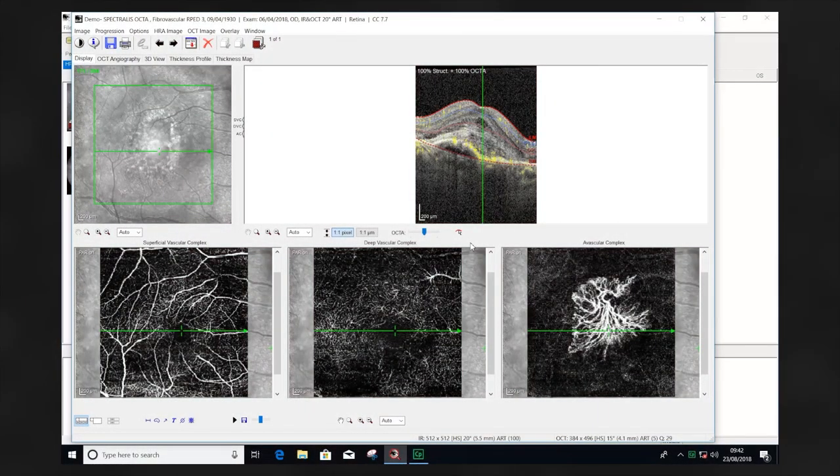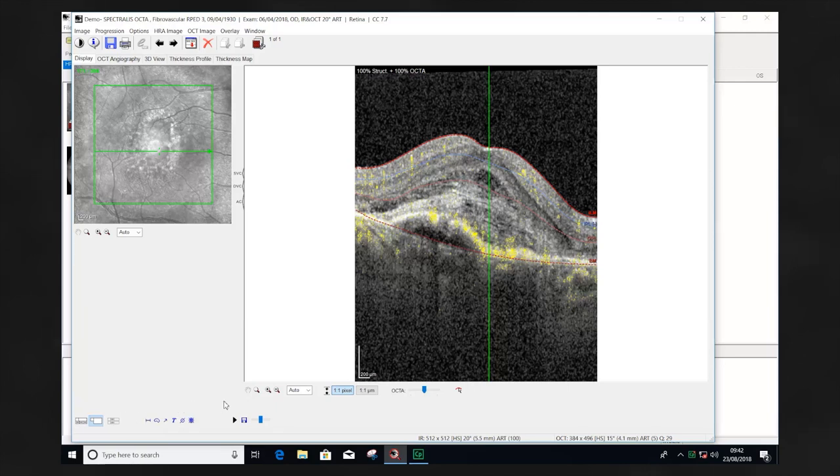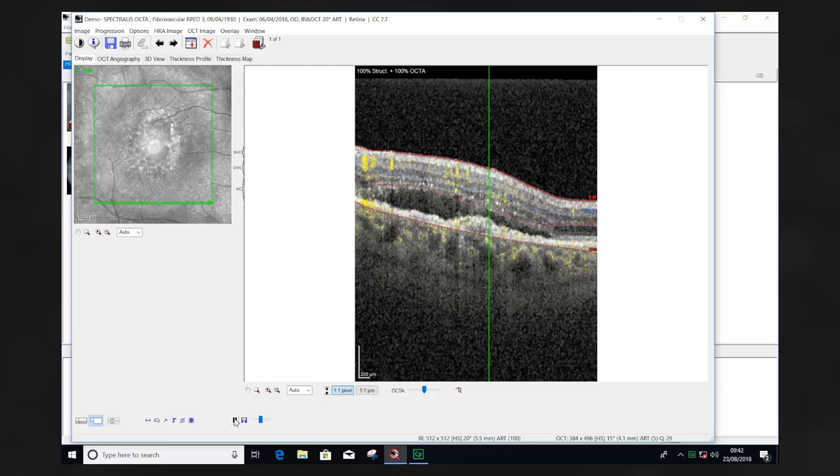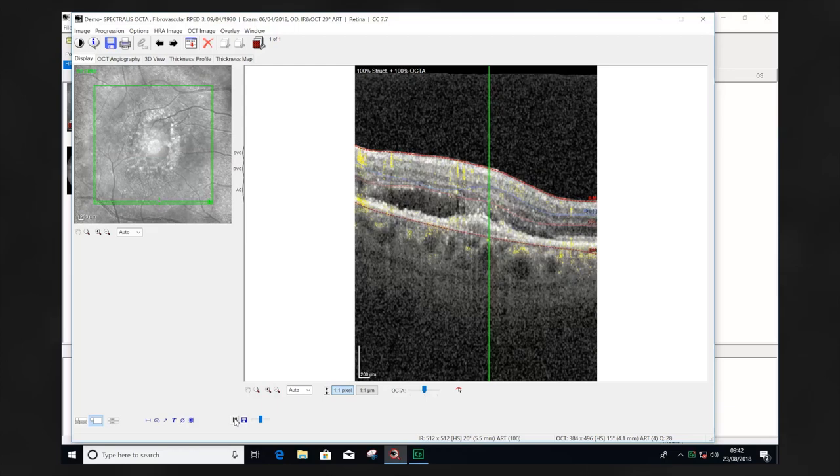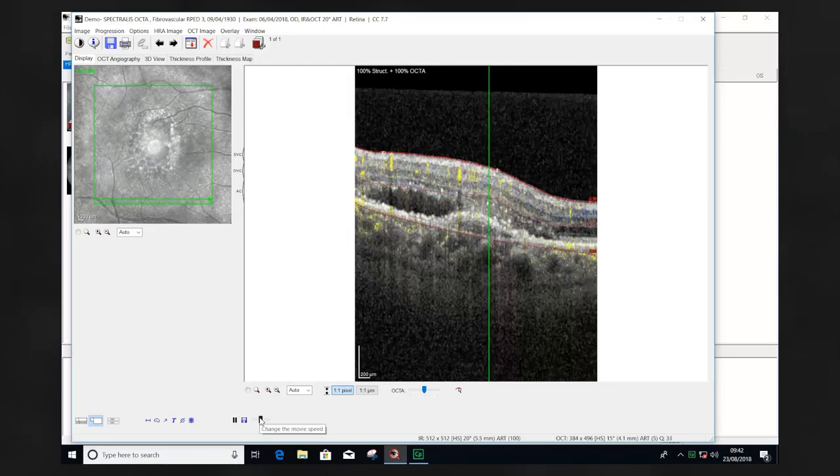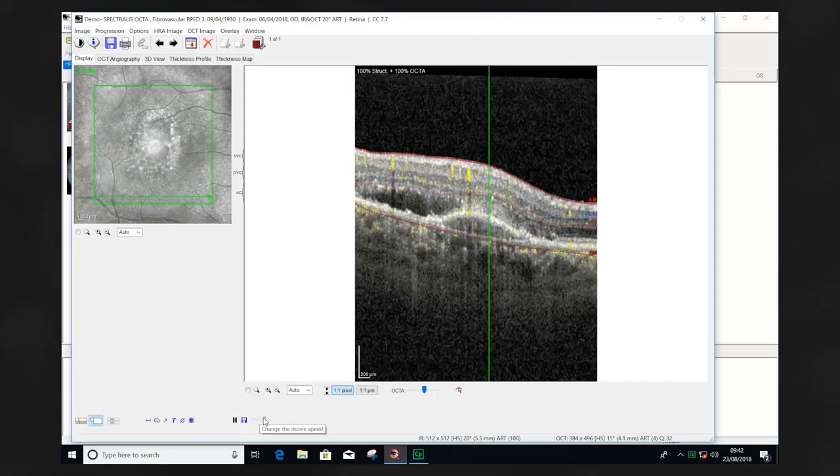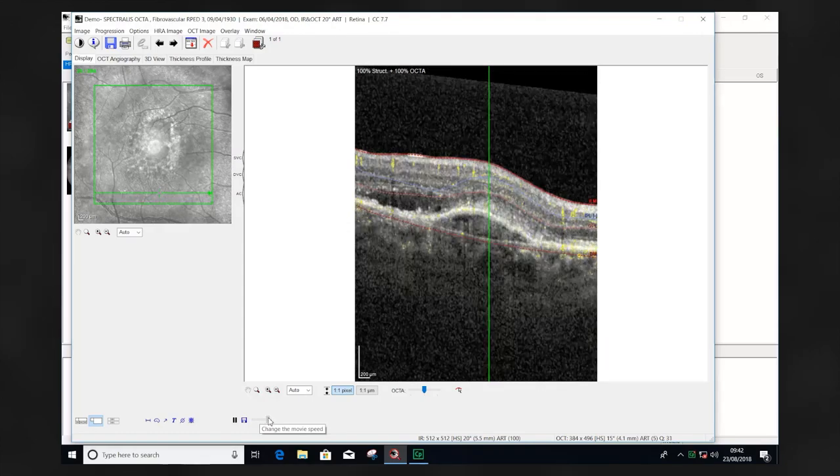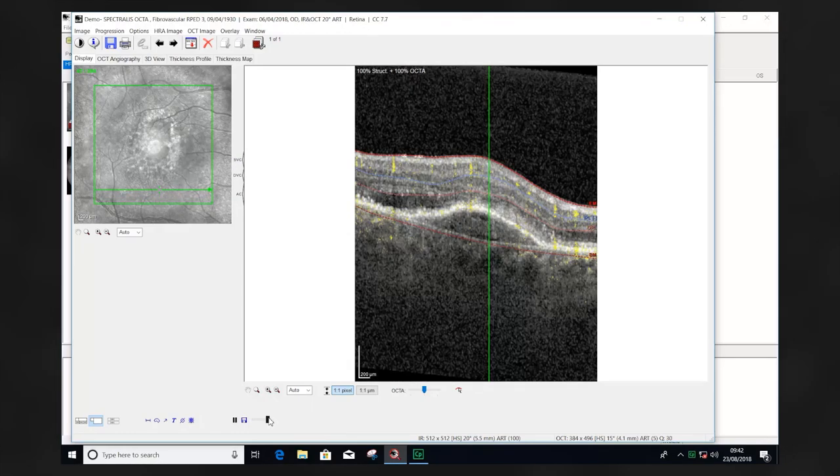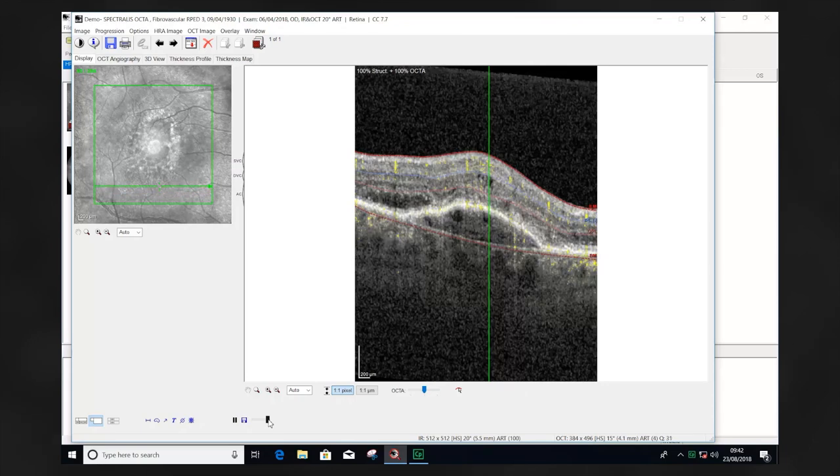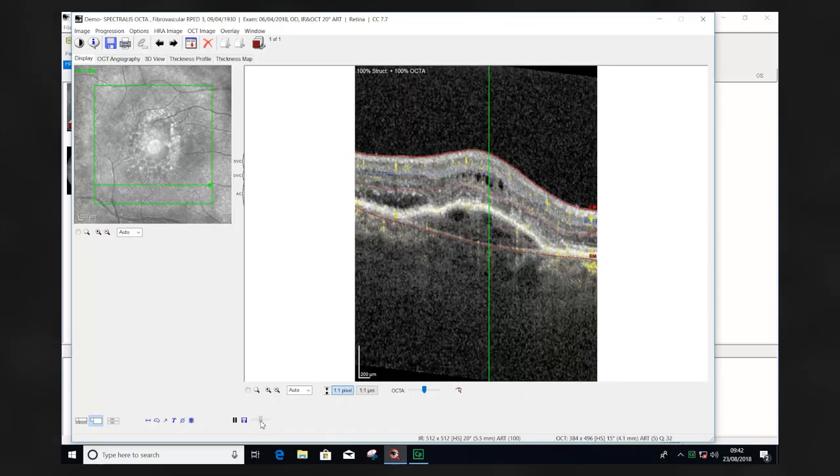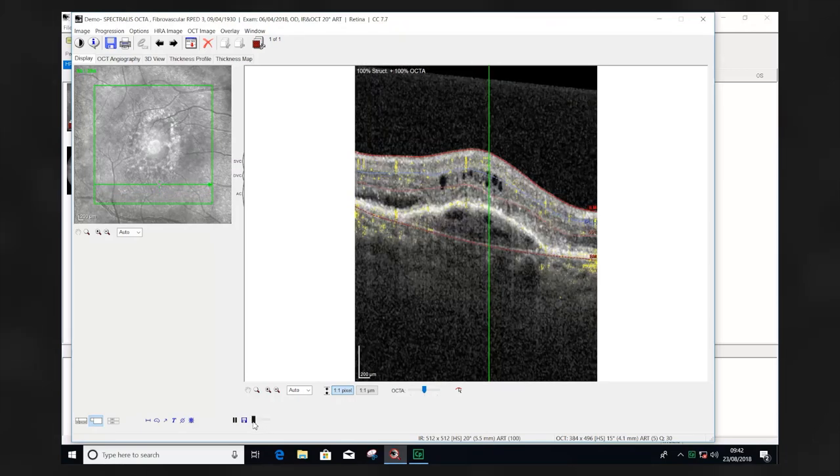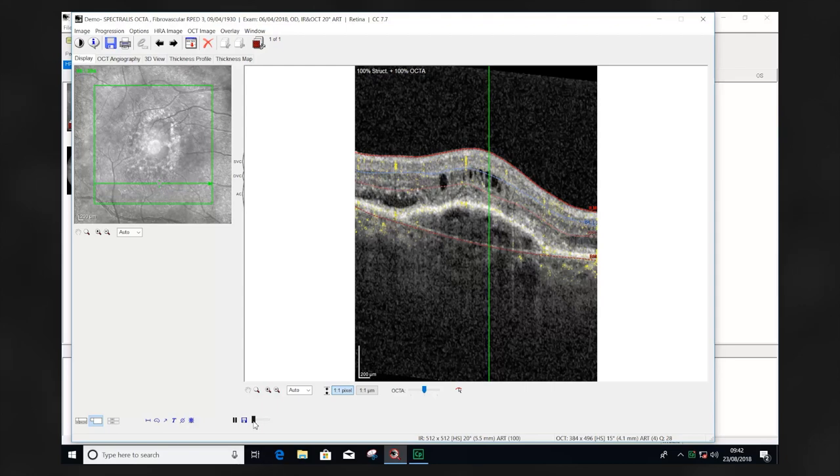An additional useful display modality is the B-scan view. This allows you to fly through the volume scan comparing the location of flow information and the correlating structural changes. The speed of the replay of the video can be adjusted and the structure and flow information isolated.